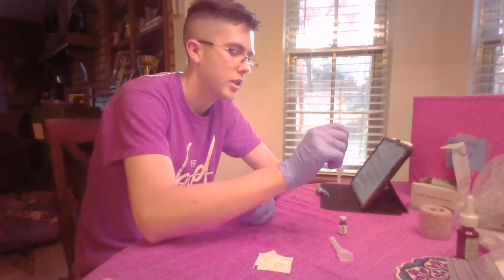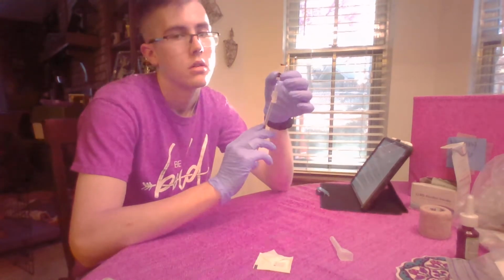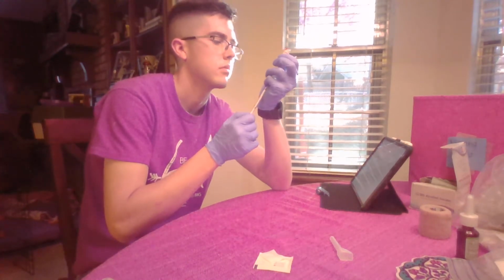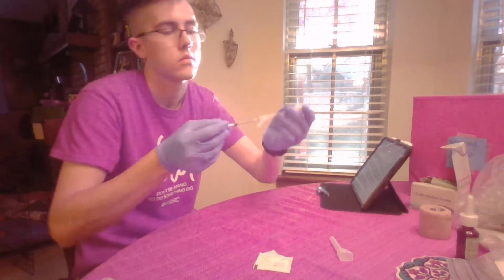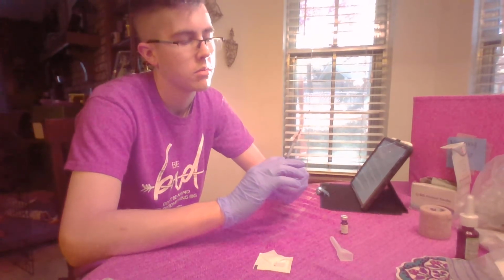Draw back to 1 milliliter of air, insert it into my vial, push it all in. Remove all the air bubbles.